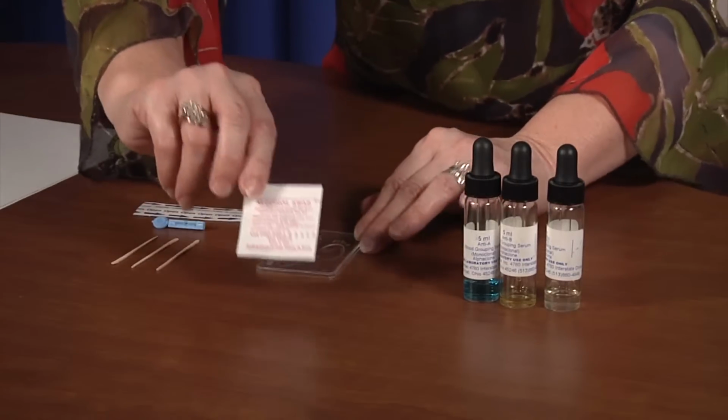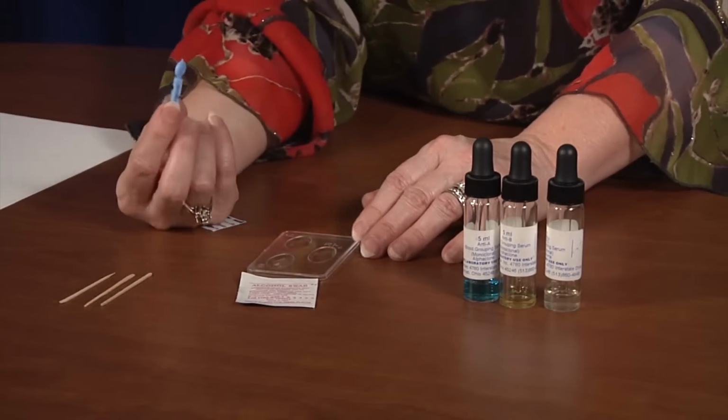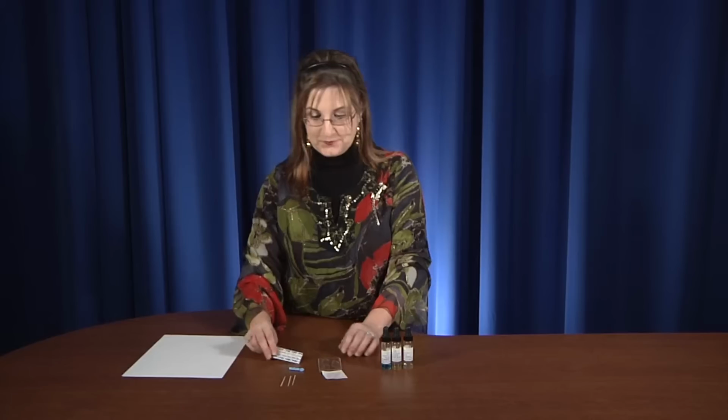You're also going to need an alcohol prep in order to sterilize your finger. You'll need 3 toothpicks. You're going to need something sharp, such as the lancet, to poke a hole in your finger, and if you bleed a lot, a Band-Aid.